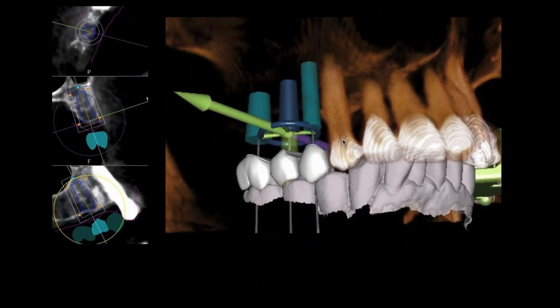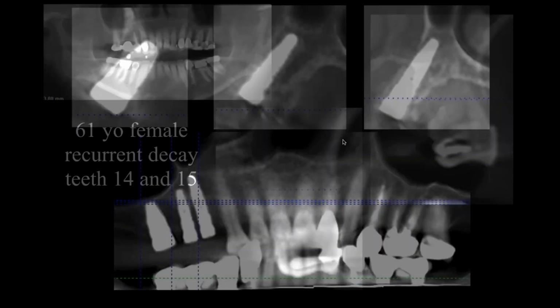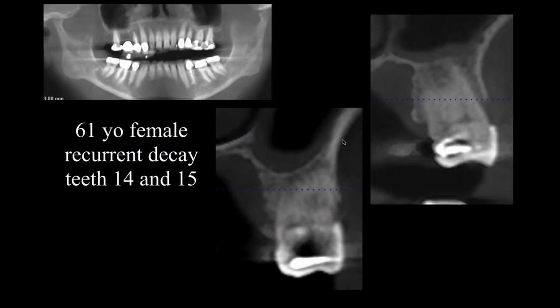This is easy. Now, when I put the implants in, I have them lined up just like you see. And then on this particular navigation system, I don't need any of these images. I just put the implants in, and I use it because the plan's made. So here's the plan, and here's the implants in position. So they're right in the middle of the alveolus. And you can see on any of these implants, if I had gone freehand, I could put them all over the place. But they're lined up, and they work fine, and she got restored without a problem.